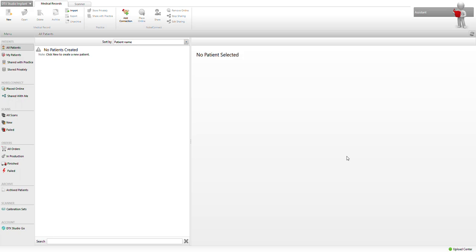Alright, I'm going to go ahead and plan with DTX Studio Implant a simple number 19 lower molar implant with a surgical guide. We're going to utilize Smart Fusion for importing the intraoral scan along with Smart Setup to help us position the implant for optimal restoration and aesthetics.